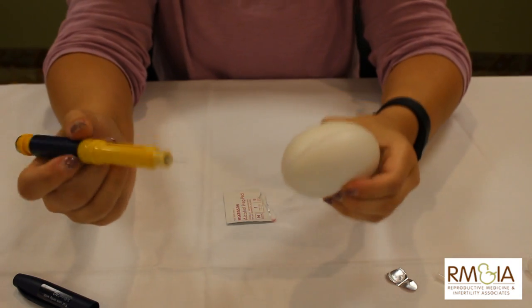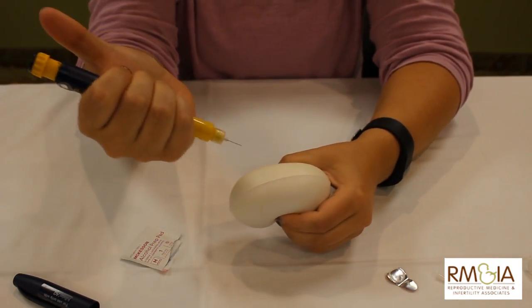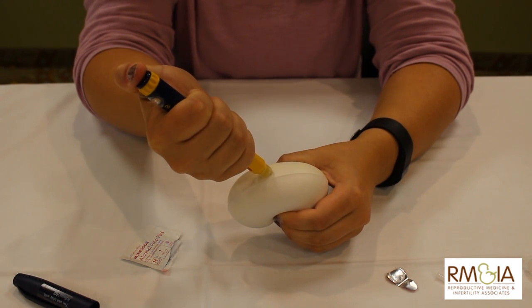Get your pinch of skin, clean it off with an alcohol wipe, hold it like this, inject at a 45 degree angle, and press the button down all the way.